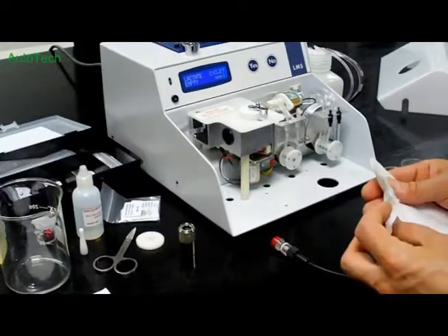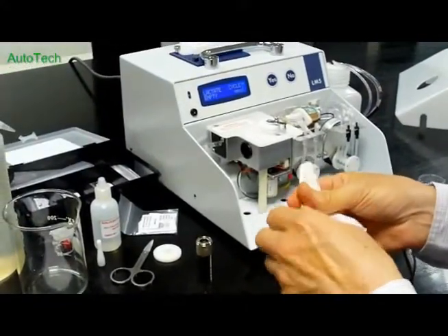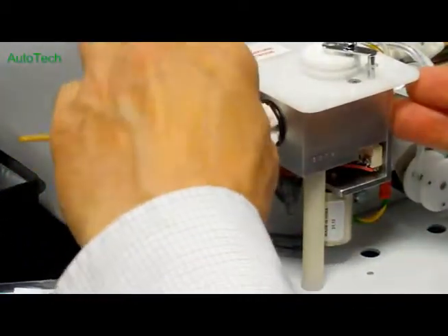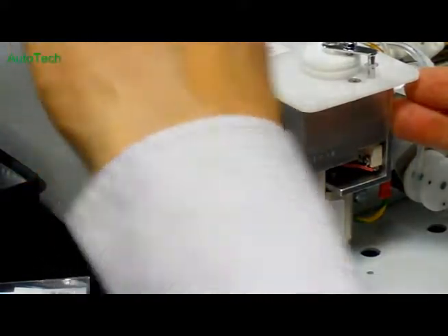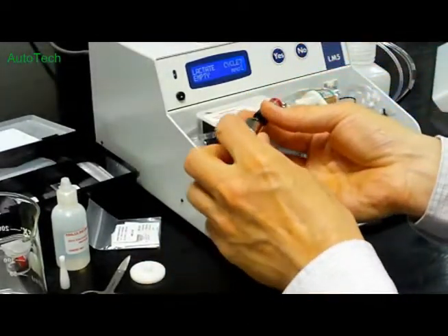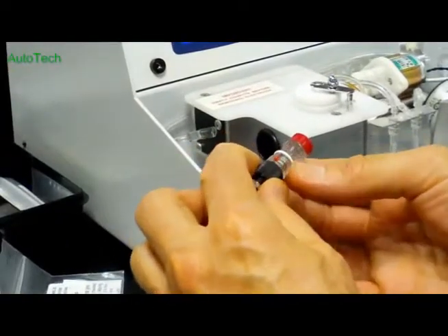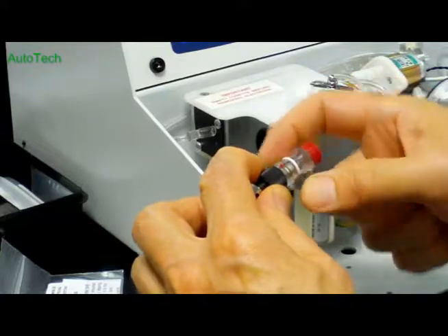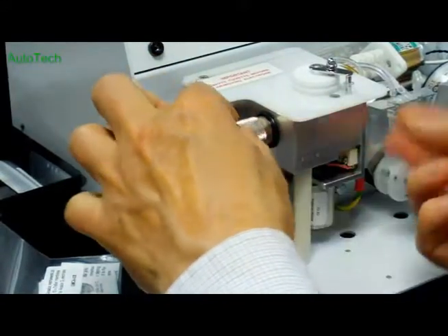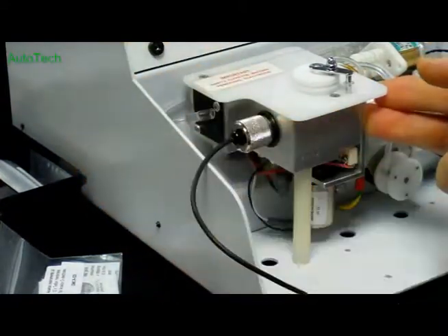So before reinserting the electrode, we need to make sure the electrode aperture is dry. So using a tissue, just dry up inside the electrode aperture, just to make sure there's no moisture at all. Okay, so now we're going to reinsert the electrode. And it's always good practice to have the red dot uppermost, and just double check the O-ring is in place over the bleed hole. And so sliding it into the electrode chamber, just locate the bayonet, and you're turning clockwise, you'll feel a gentle click to confirm that the bayonet is in place.